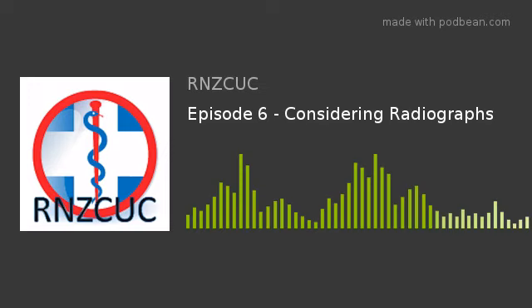With cervical spine views, there's the standard ones that you do. There's the AP, the lateral, the open mouth peg view, and then you also need to visualize the C7T1 interface so that there's none of those rare but potential dislocations that you can miss. And there's a couple of ways that you can visualize that in patients that we might refer to you. Yep. And the swimmer's is one of those. Yep. What is a swimmer's view, and how does the patient have to position themselves for that?